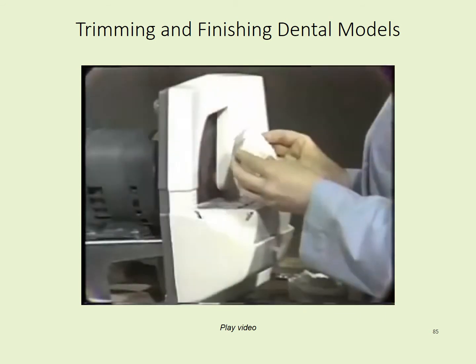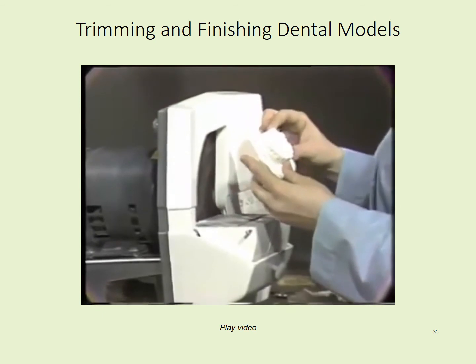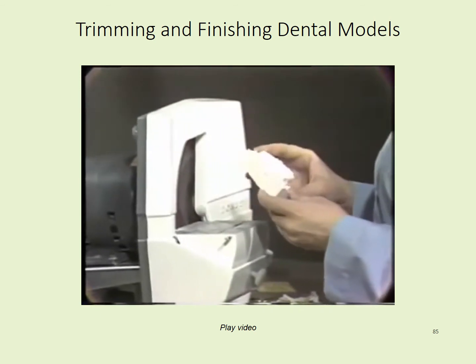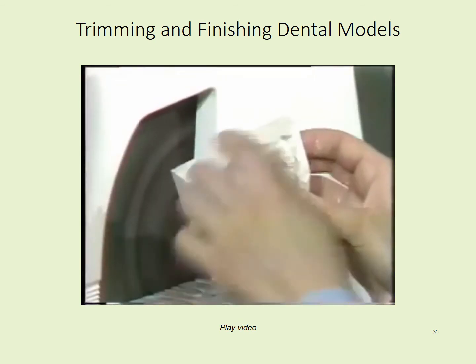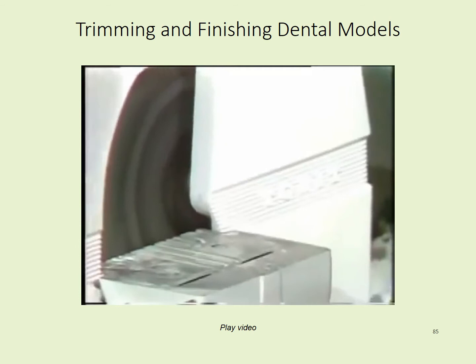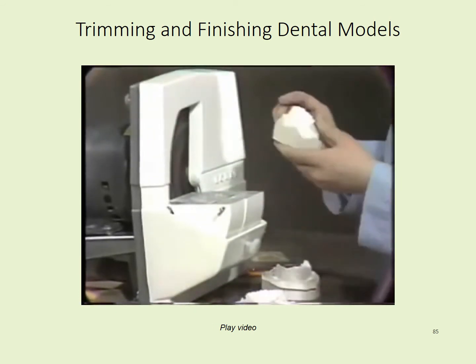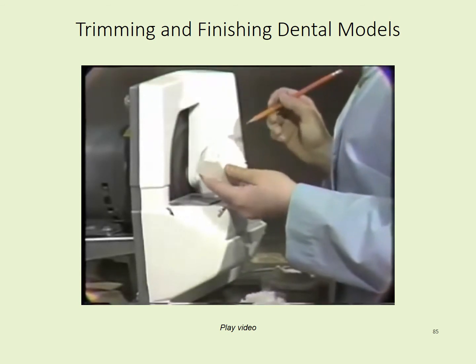Make sure in doing this step that you don't trim in too far. When the back is trimmed, you can then trim the side. I prepared a cast here to show you what we're aiming for in the sides.